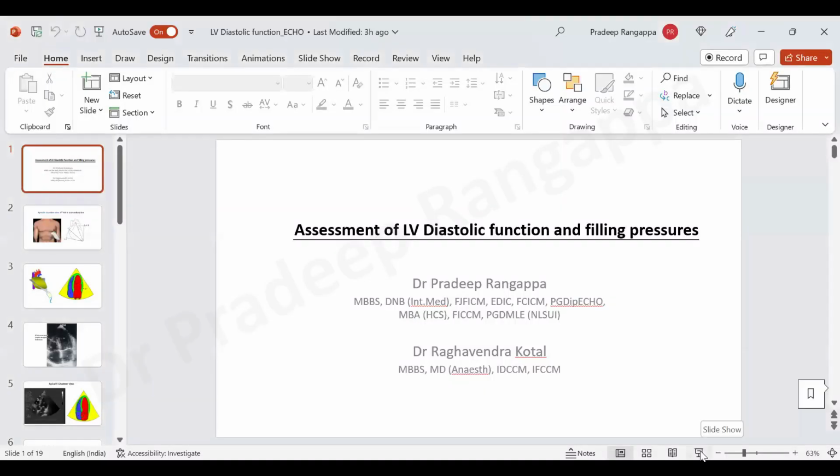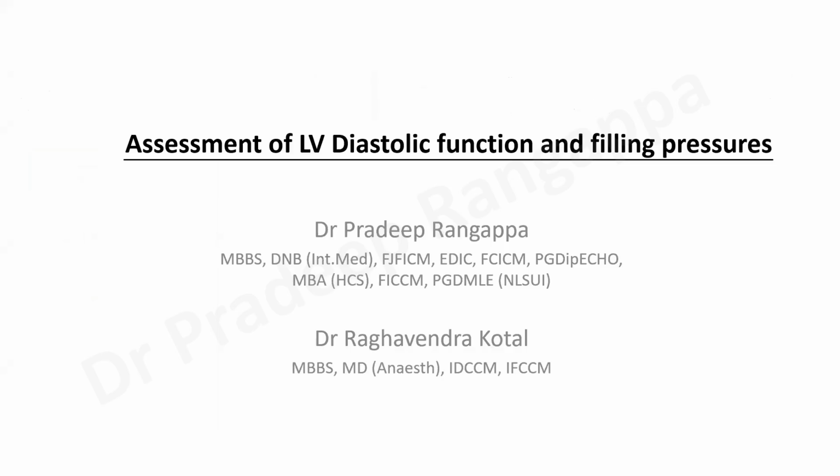Hello, friends. So, I'll be talking on this assessment of LV diastolic function and filling pressure as a part of ECHO series. So, I realized that I had not done this recording when I was doing the talk yesterday on heart failure with preserved ejection fraction. So, it's a brief overview, just as an extension of the talk that I've recorded on heart failure with preserved ejection fraction, where we did discuss the whole concept, where we need to ascertain that there is diastolic dysfunction.